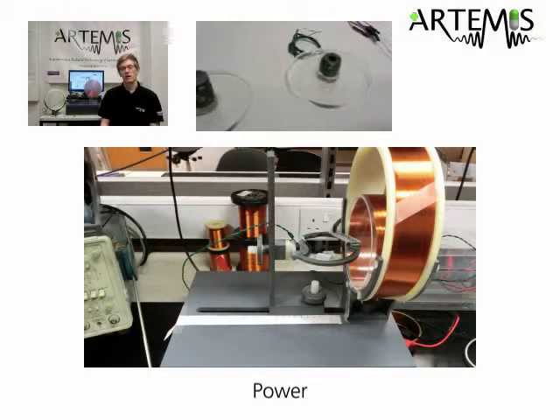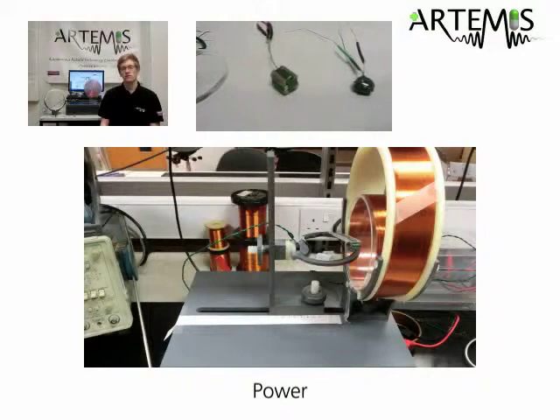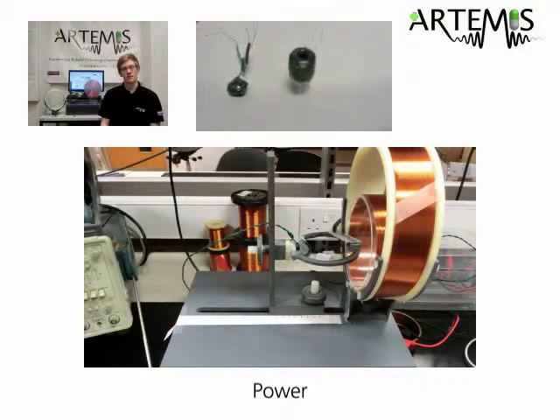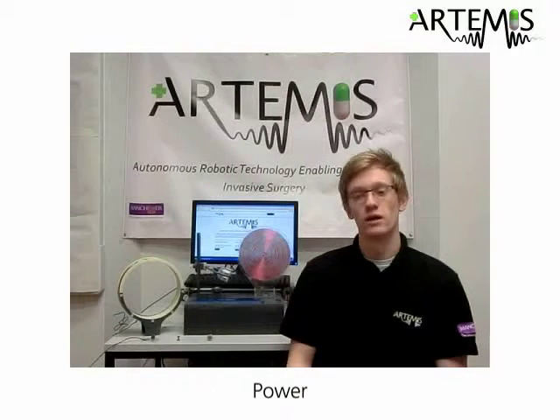Reviewing this design of the primary and secondary coil to maximise power transfer called upon the theory of resonance, where the coils are capacitively tuned to operate at exactly matched frequencies. In addition to this, by increasing the surface area of the secondary coil and using ferrite as the core material, a power system was implemented capable of transferring 25 milliwatts of power to the capsule. The system efficiency was calculated to be 1.75% through porcine tissue.